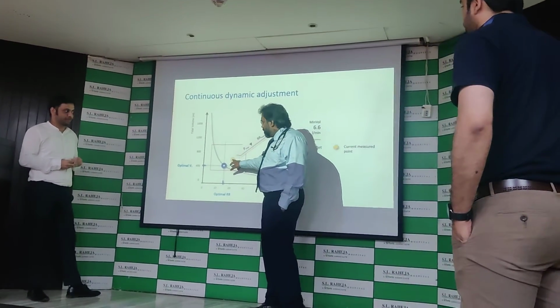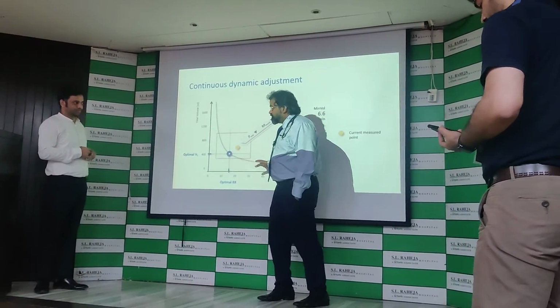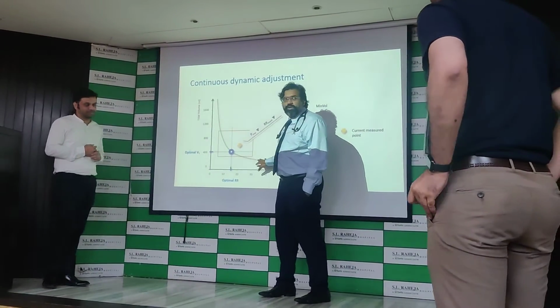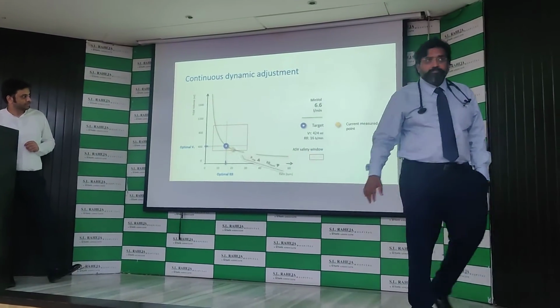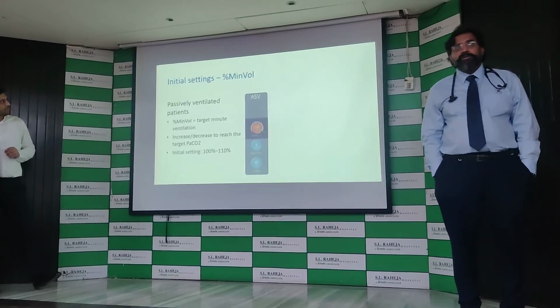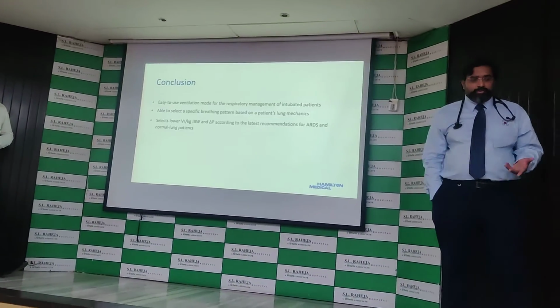If the point convincingly comes outside here and does not come back, it means there's something wrong with the patient, and we need to quickly take care of this patient. For that evaluation also, it will try to do a test breath again, and then it will check. Probably it will do it every time it goes out.